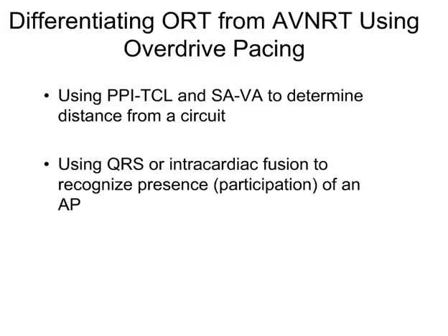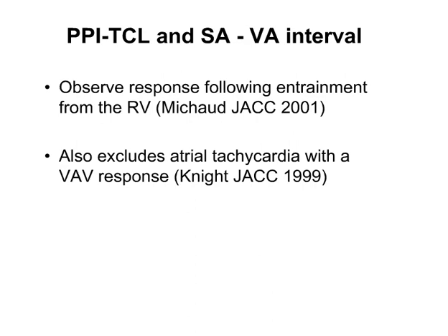Here, we're going to talk about two things using overdrive pacing instead of PVCs. One is looking at the beginning where you look at the zone of fusion, and the other is looking at the post-pacing interval and stim A minus VA.